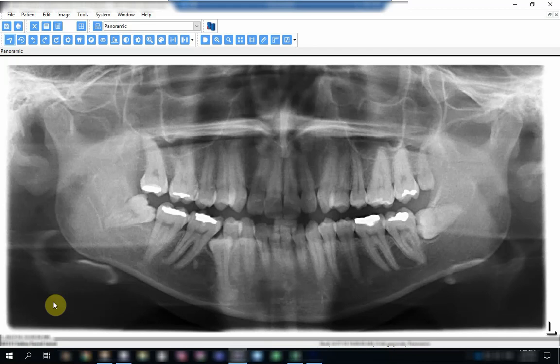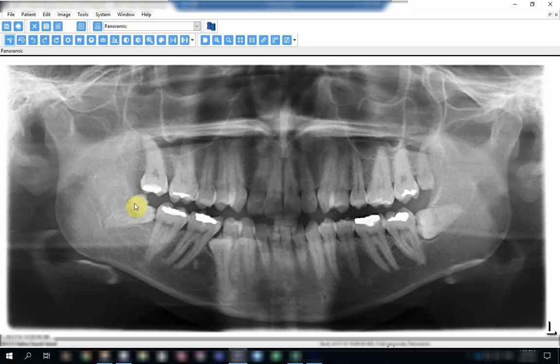Now in this OPG for the patient, we will have a look at tooth 48, the lower right third molar, which is partially erupted and mesioangularly directed. There is no chance of eruption as you can see.